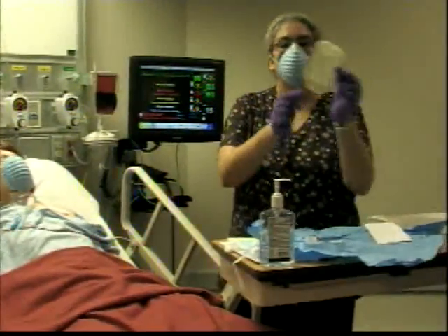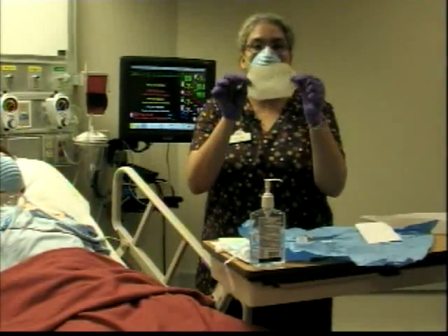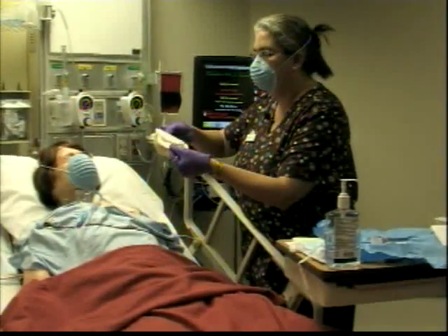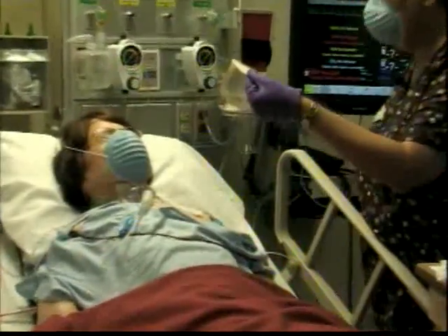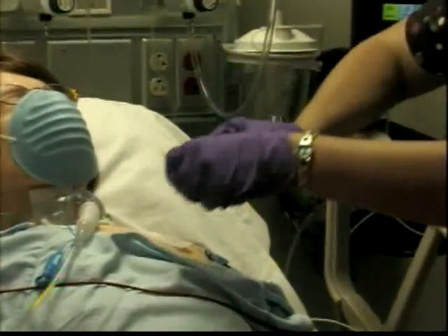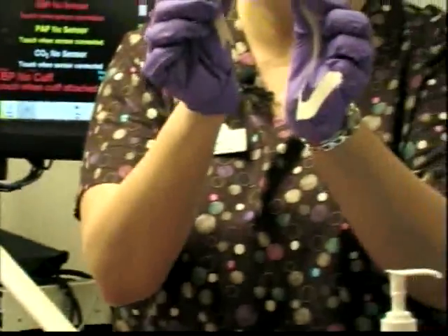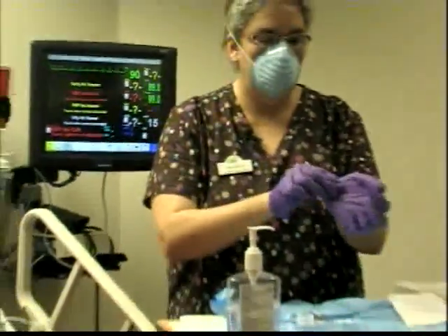You're going to be using now your Tegaderm, and because it's so large, you need both hands. So you're going to come back in here. You're going to remove carefully the tape. Then you're going to make sure that you cover the whole site. The same thing we did for the IV. Remove this part. Okay. I still want to save this because it has the little tape where you can put the date, the time, and your initials. So you put it on the side for a minute.